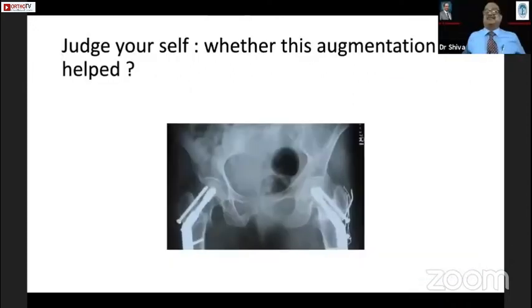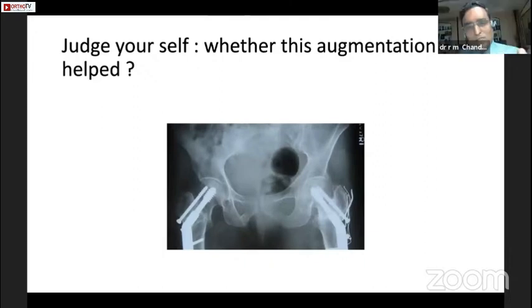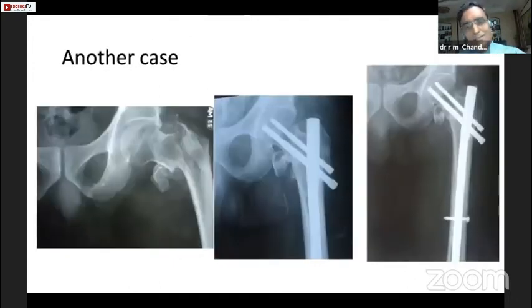So, friends, what I would like to emphasize is augmentation, whether it is really helping or not, I have my own doubt. This was a patient without augmentation. A similar fracture had augmentation of the lateral wall and tension bands added on to the lateral side. The healing was the same without much difference. So what I'm debating is augmentation versus no augmentation.